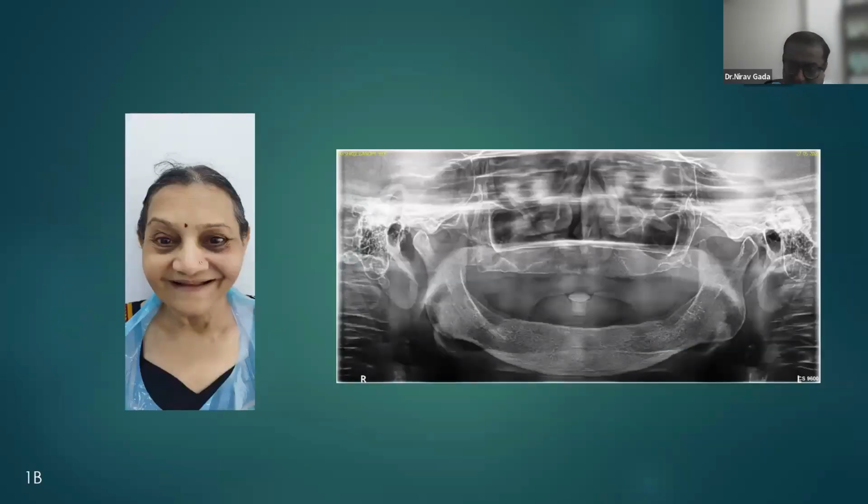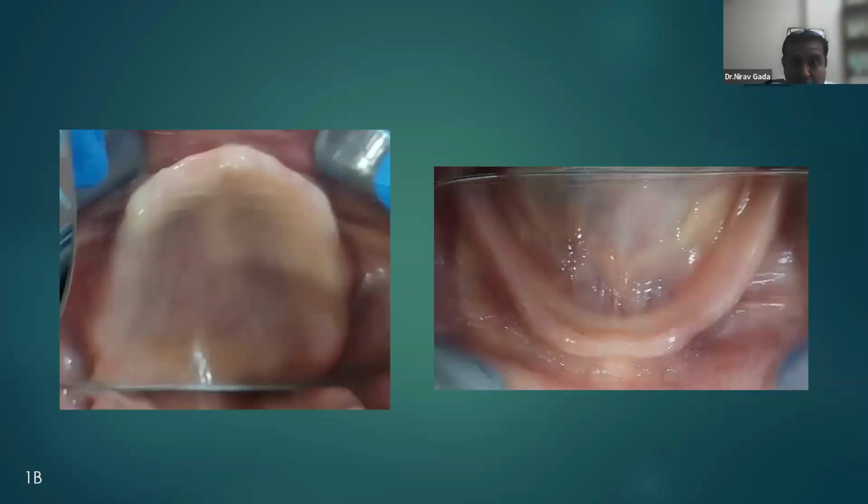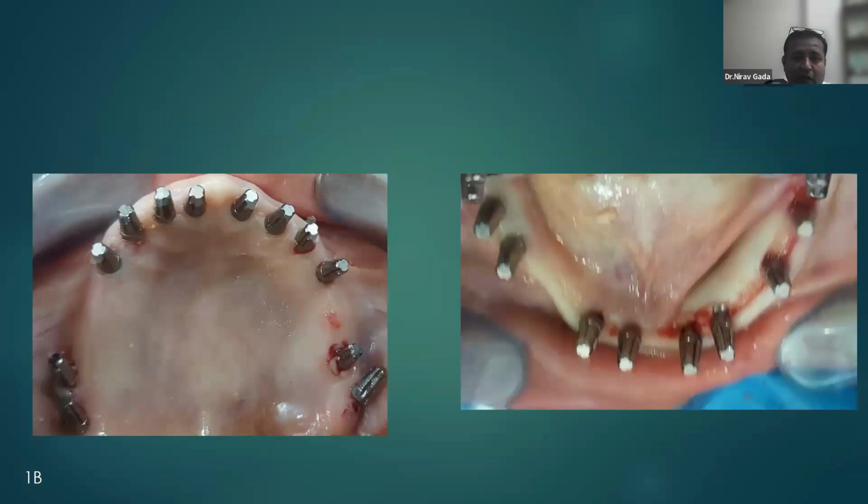So this is just one case of basal implantology to explain what basal implantology is exactly. Here is a case of a completely edentulous ridge, and here we have used a flapless technique with one or two burs. Generally, we place the implants. In the maxilla, you can see we have engaged the pterygoids on both sides, a double pterygoid, and we are engaging the nasal floor from premolar to premolar region.